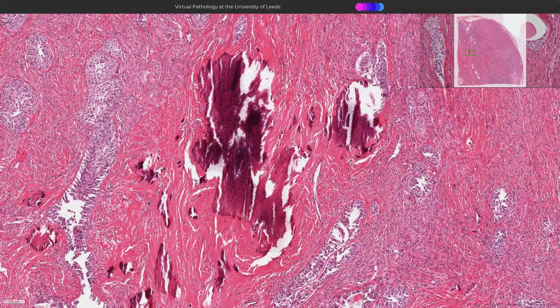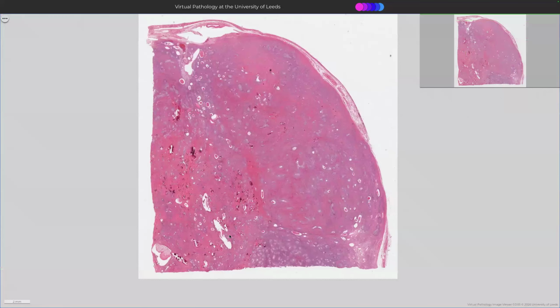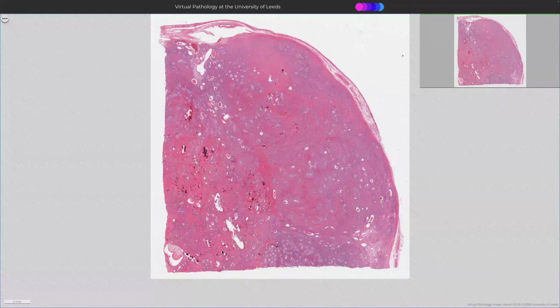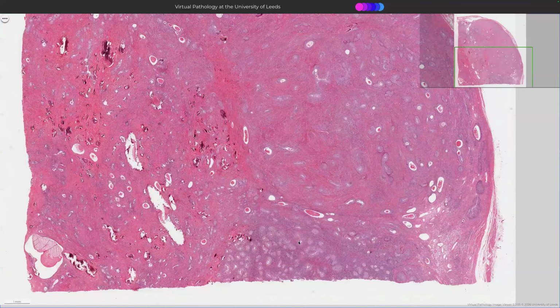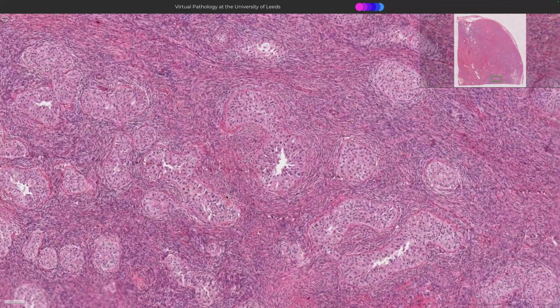Yeah, calcium. Because the Brenner tumor is so slow growing and has been hanging out for so long that the fibrous tissue becomes calcified. And calcification is usually a reassuring feature that things have been hanging around for a long time. Not psammoma bodies, however. Okay, so that was just a nice straightforward one to talk about, Brenner tumor, commonly seen. You just have to get used to recognizing this kind of little insular pattern, and then you feel really clever and go, oh, Brenner tumor, yes. There we go.